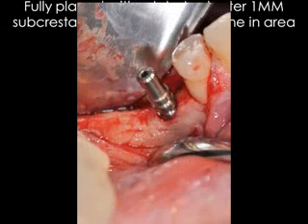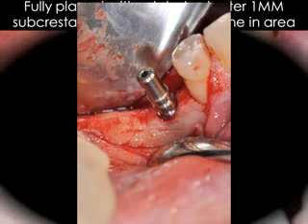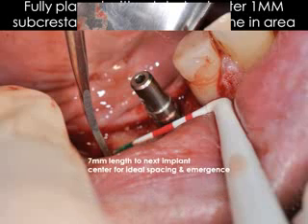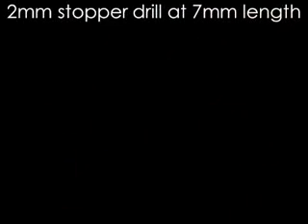There you see the ratchet extension in place. And now this is a really nice pathfinder that screws into the implant once your implant is in place. You can utilize your pathfinder for future placement and for checking your parallelism at every chance you can.